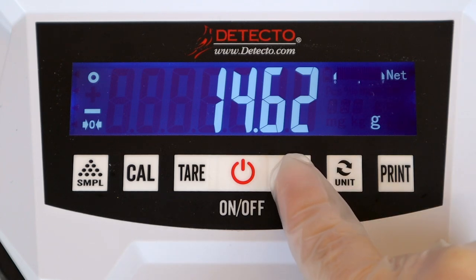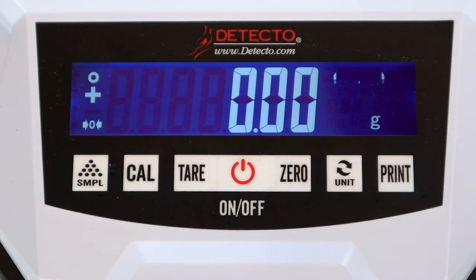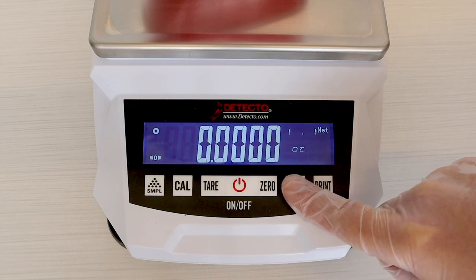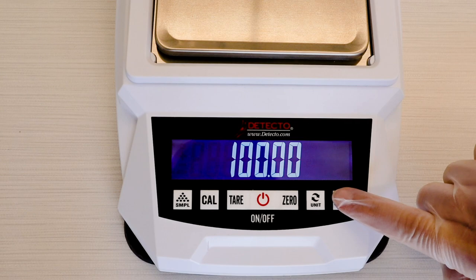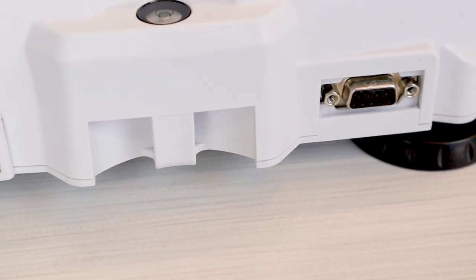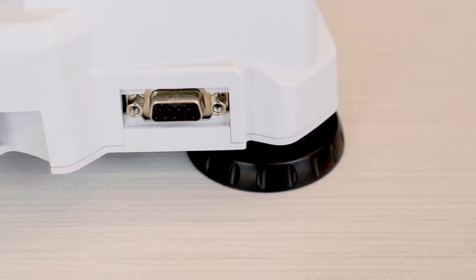The zero button is used for resetting the weight display to its zero point. The units key will change the weigh mode. Lastly, the print button will instantly transmit data via the RS-232 to a connected printer, computer, or other RS-232 device.